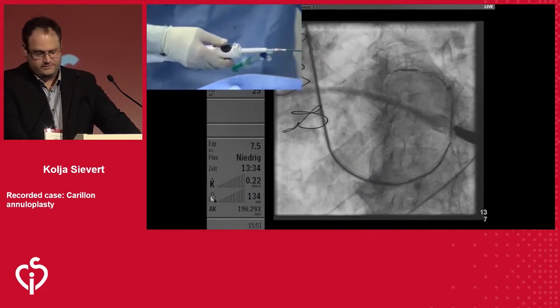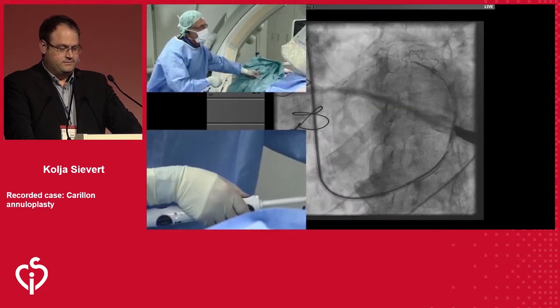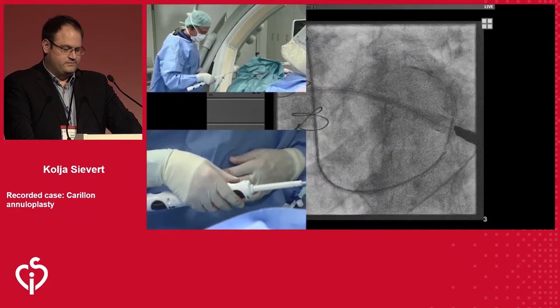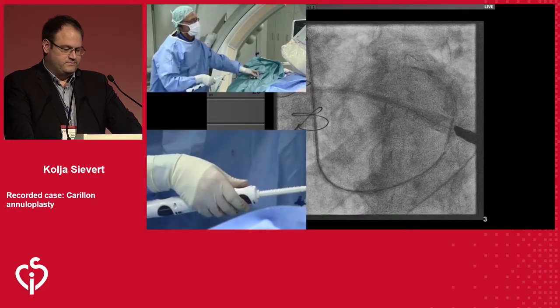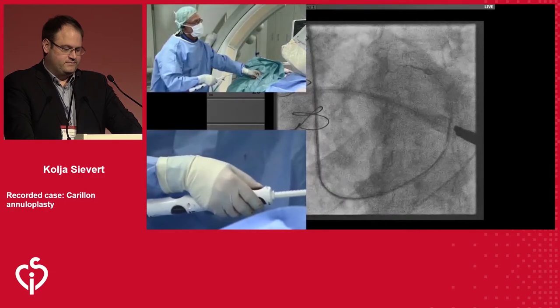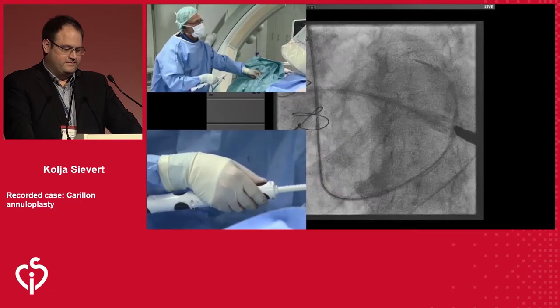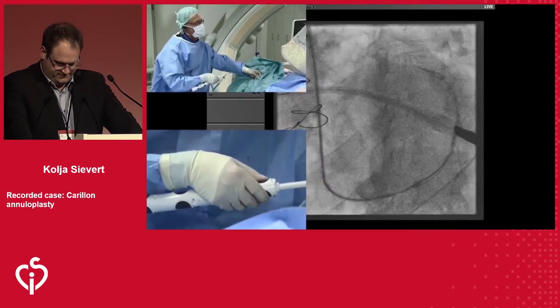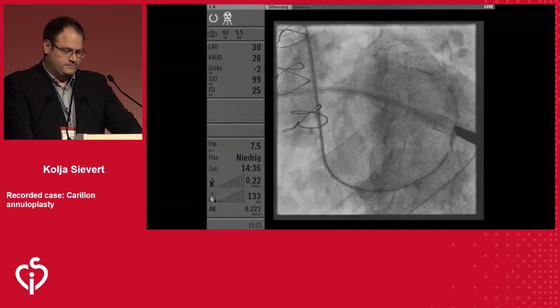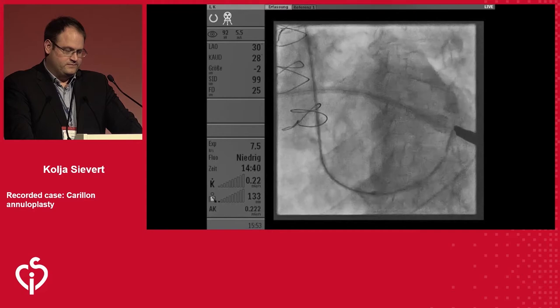Okay. And now we need to lock it. So now I'm rotating in the right direction. I felt a little click. That's it. I think I'm in. So now you can go the other direction again to move the catheter away from your lock. And then we'll see. Now I'm rotating again to the black direction and gently pulling on the guide. At the same time, I'm slowly pulling back the guiding catheter.